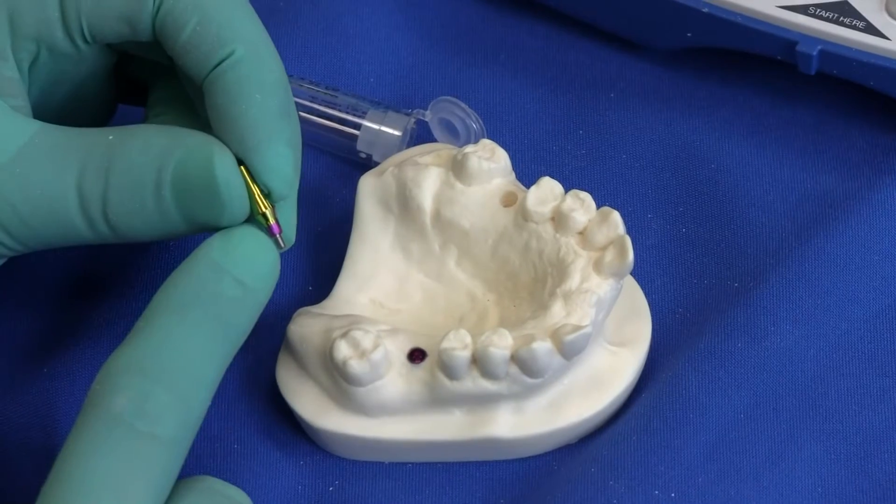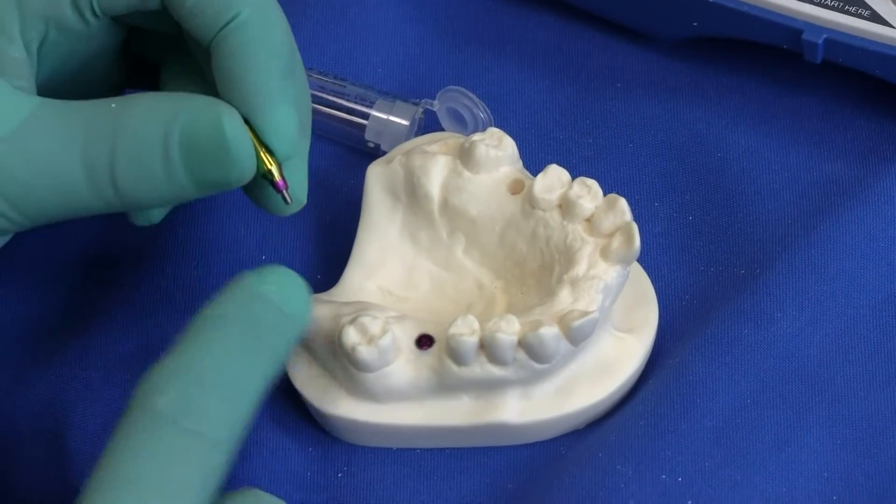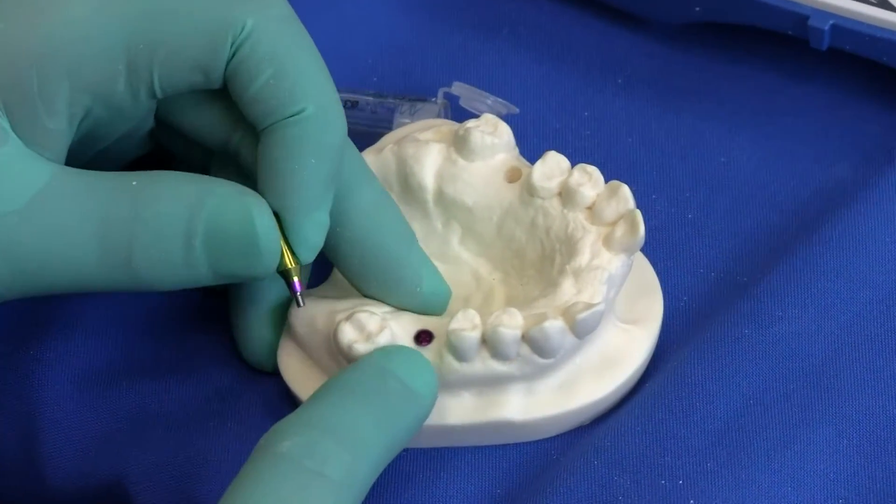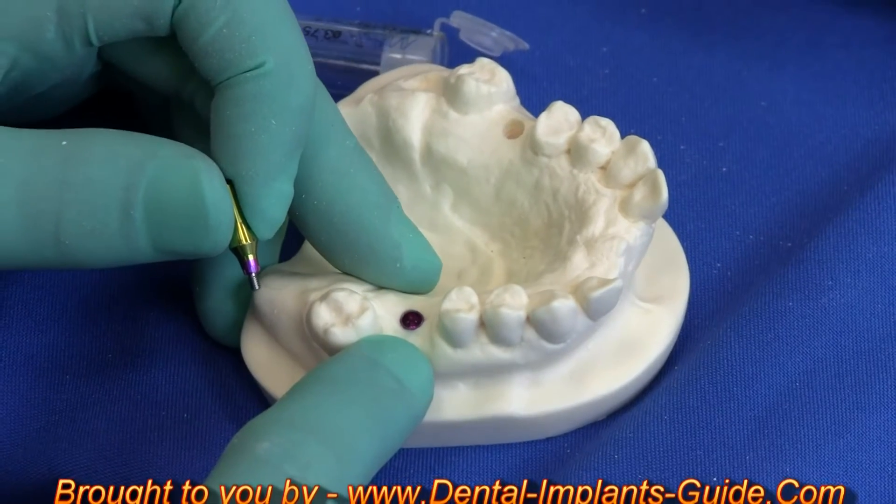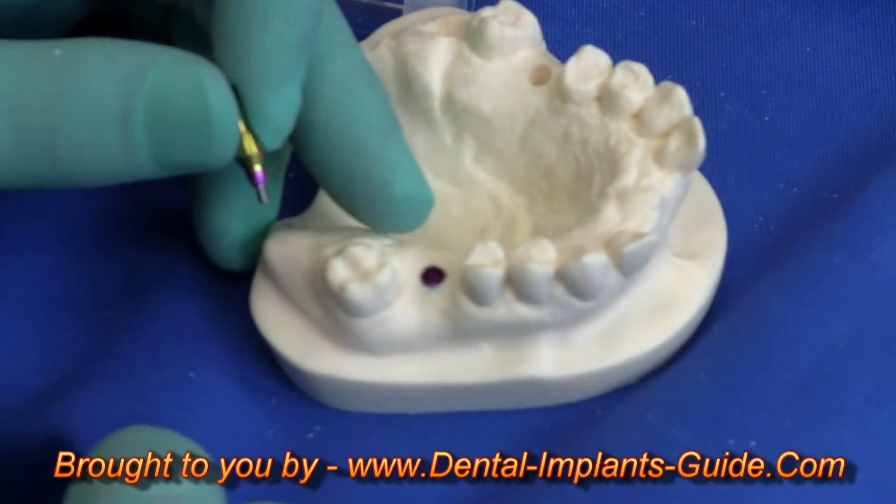You see the abutment is color-coded purple at the bottom to demonstrate that it will fit only into the purple, which is standard platform, either 3.75 or 4.2mm.